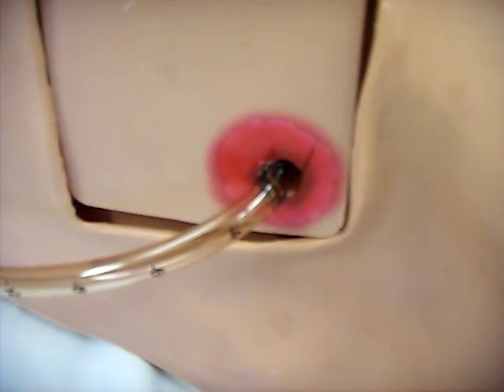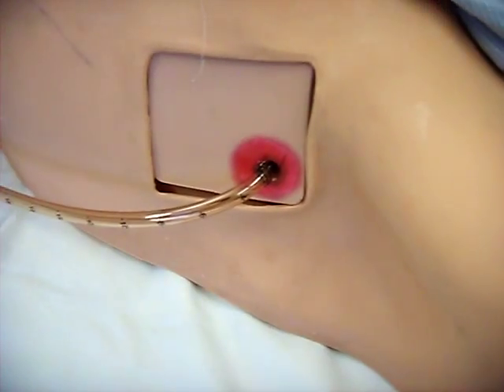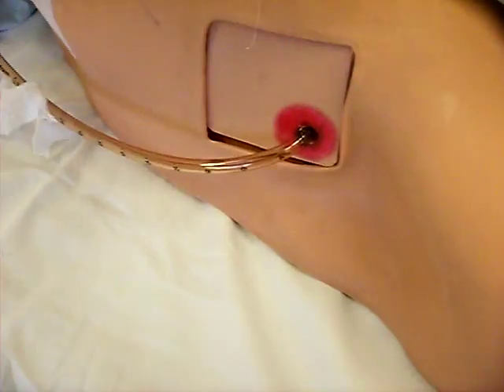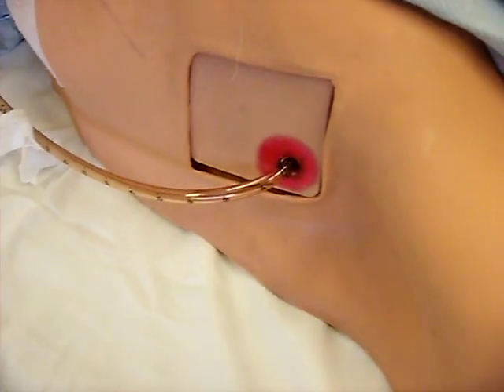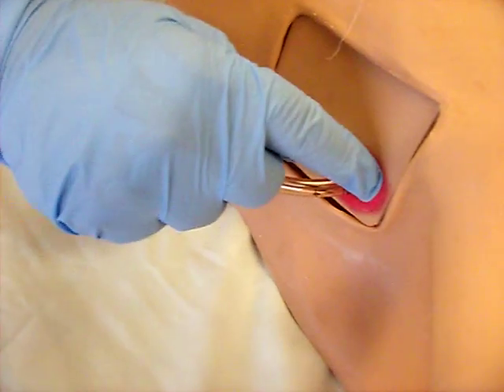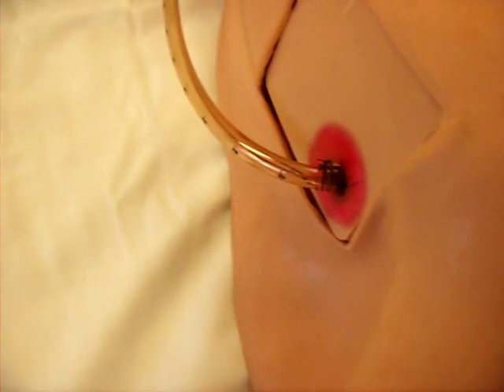This is one of the parts that you have to be really careful about examining once you get it cleansed up, knowing exactly where your suture is entering the skin, and where to cut it close to the skin, so as not to drag anything from the surface down and through. So standard suture removal applies. You want to cut it and drag back through the bottom and up, which is the sterile under the skin portion.